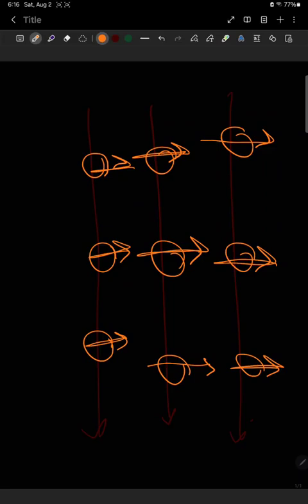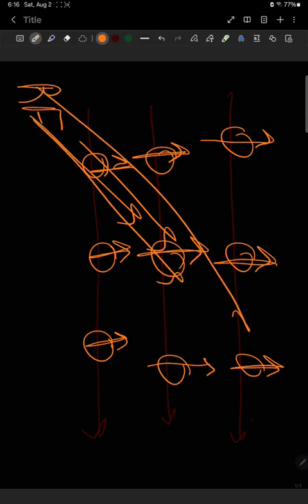Okay? Now, when I use an RF, which is radio frequency pulses, it knocks them out of their alignment. So this is my RF radio frequency. This guy, for example, was aligned with the external field. Suddenly he will be knocked out of this alignment, so he will spin in a different direction, like that, okay?